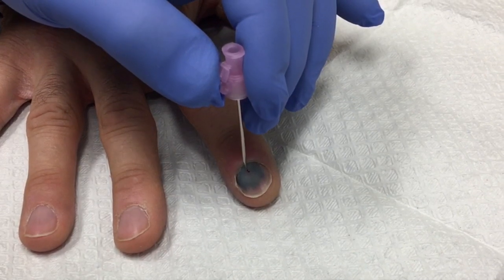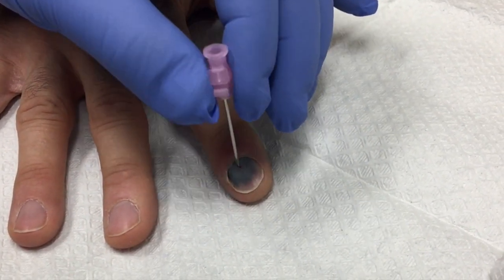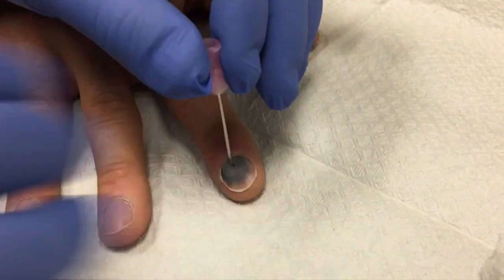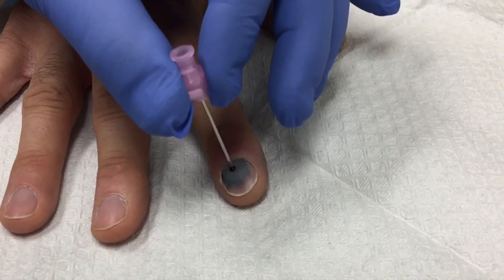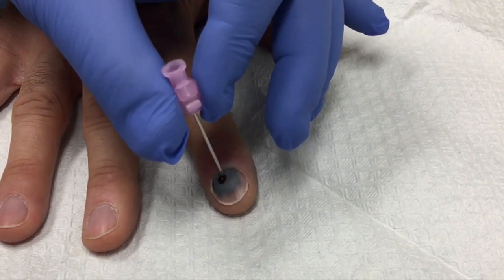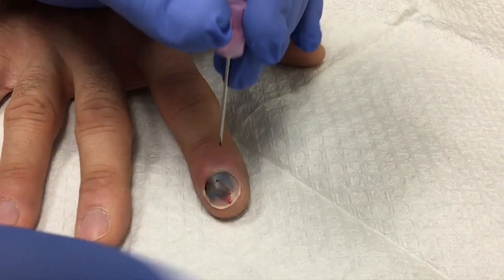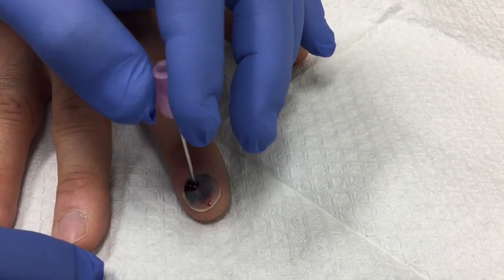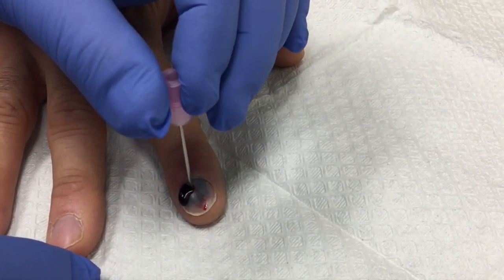You see a little blood is starting to come there — you're gonna feel better. Hurting a little bit? Like sharp? No, like pressure? Yeah, you can see the blood starting to come out. You're gonna feel better. We're gonna make a couple of these little holes here, okay?